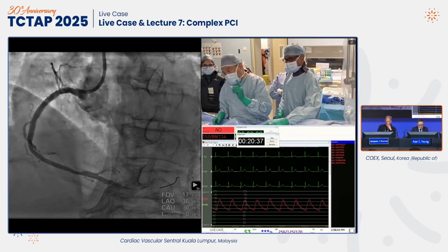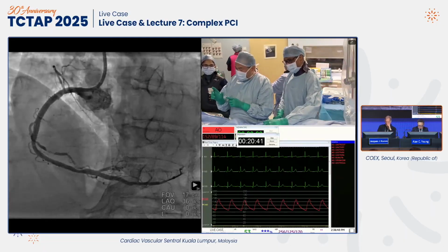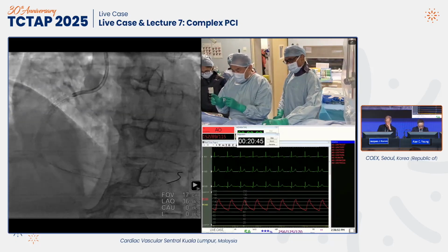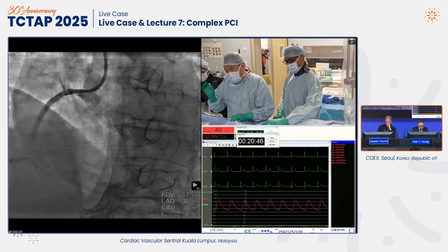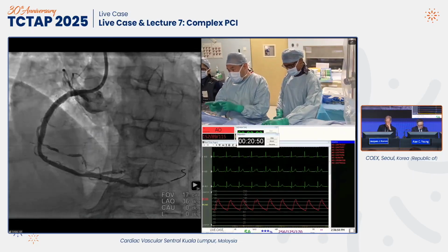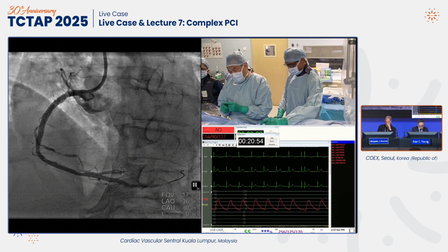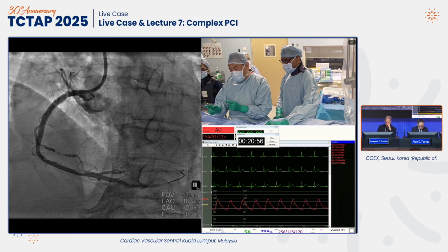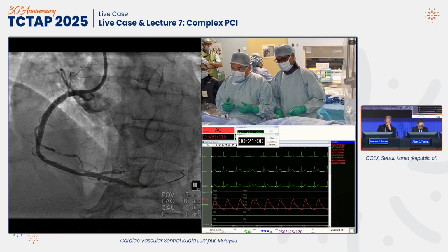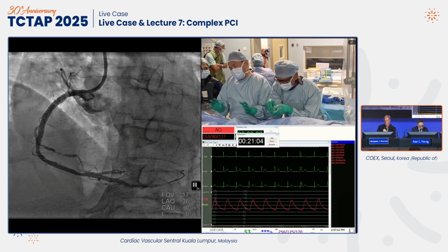I had 1 balloon rupture. That balloon rupture was because of a previous stent that was jutting out, and the balloon, I think, cut into the stent struts. Now, the good thing about this engineering way that they have formulated is that when the balloon ruptures, it ruptures linearly, not focal, not circumferential. So when you have a linear perforation of the balloon, it is safe. At least in that case, I thought it was going to be a problem, but no, it just went away, and there was no problem.